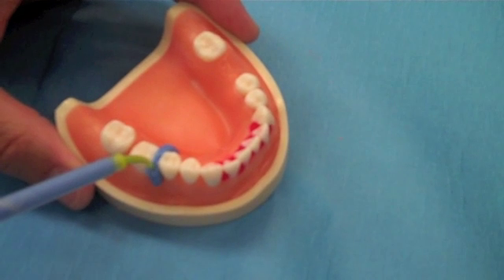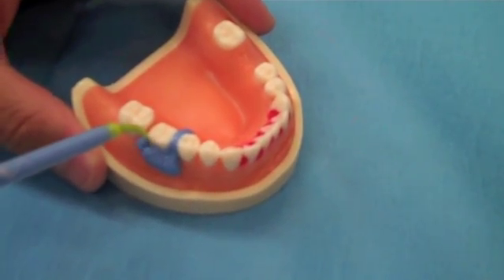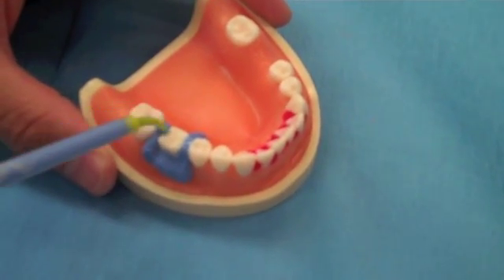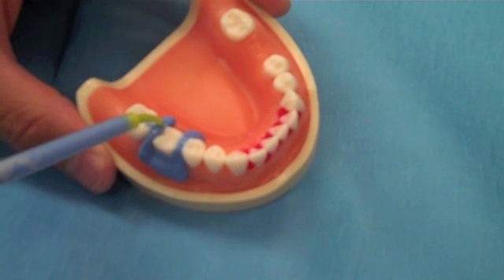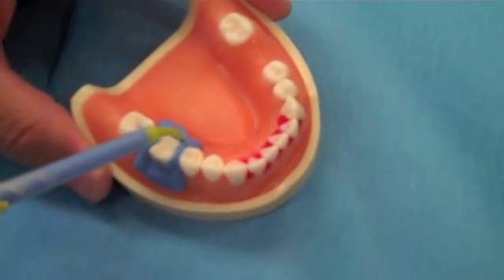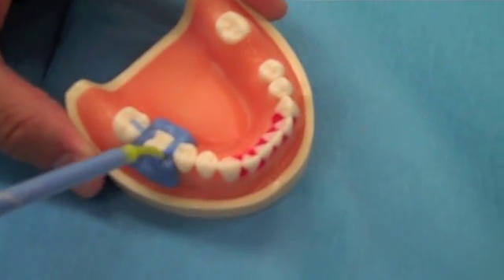Push the material ahead of the tip. Go slowly around the tooth. Do not drag the impression material, or remove and reintroduce the tip into the material. This technique reduces the risk of voids and impression pulls.